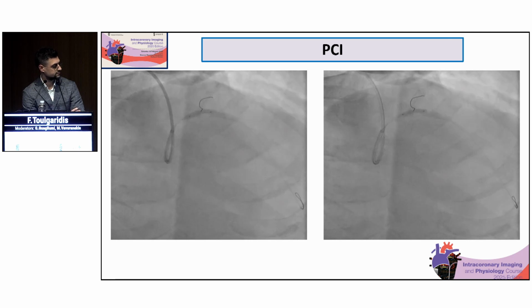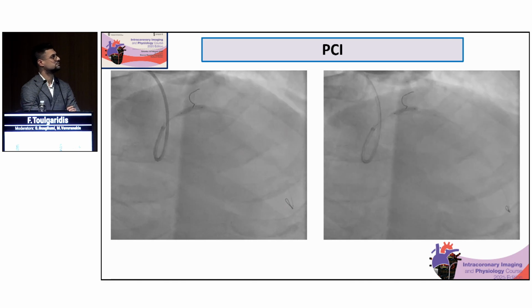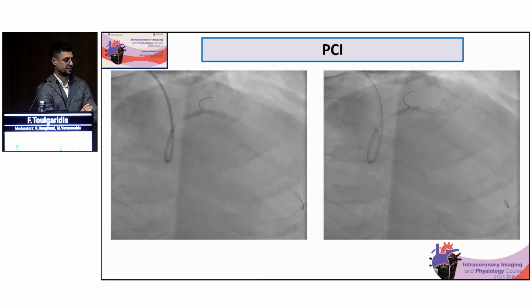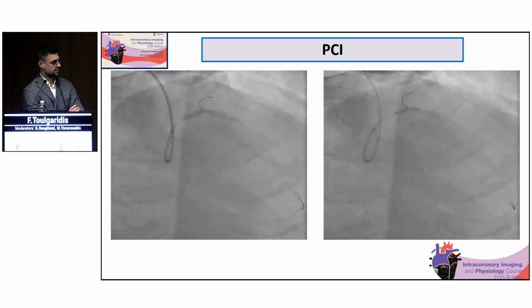Let's stop for a second. Okay. Are you satisfied about what you are seeing in angio? That was obtained after a non-compliant balloon following the shockwave? Yeah, this is the shockwave, 2 of the 6 runs of the shockwave. And then at the end of the shockwave, you are doing again an NC higher balloon? Yeah. Okay, and it was a 3.5? A 3.5 by 12 at 16 to 18 atmospheres.